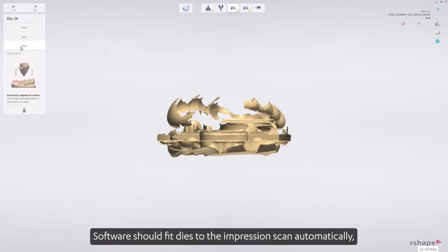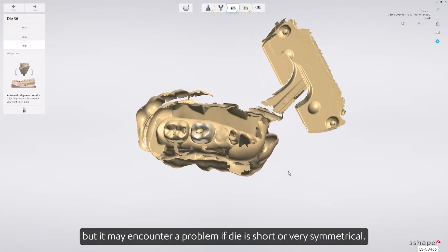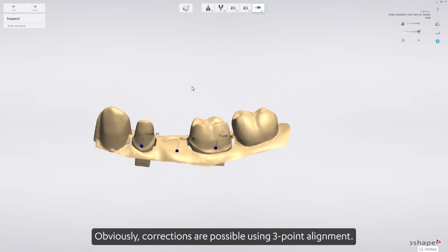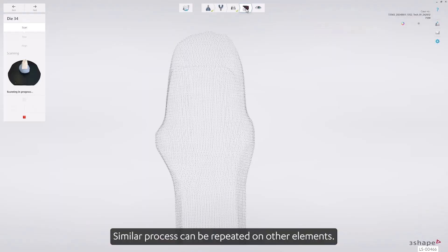The software should fit dyes to the impression scan automatically, but it may encounter a problem if the dye is short or very symmetrical. Corrections are possible using three-point alignment. A similar process can be repeated on other elements.